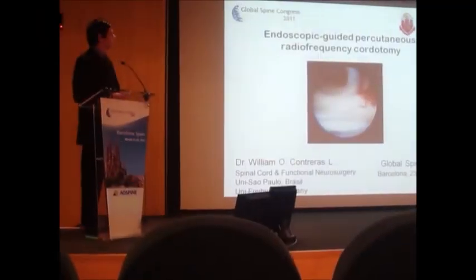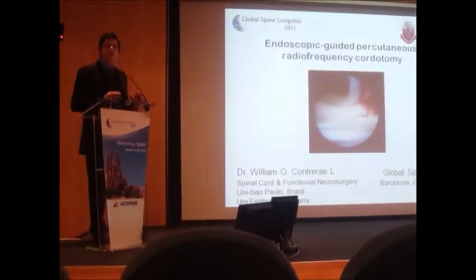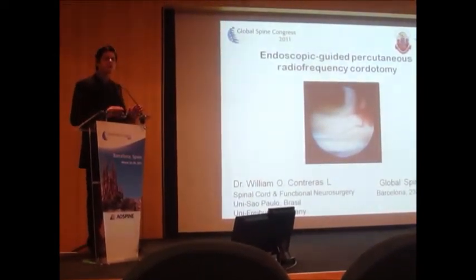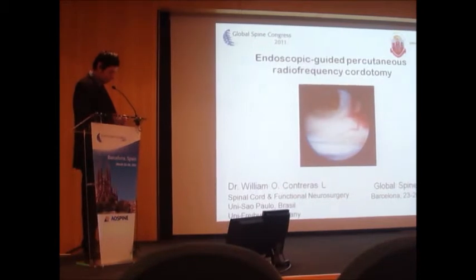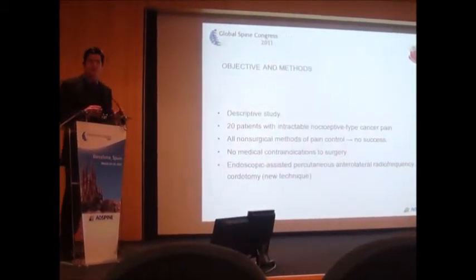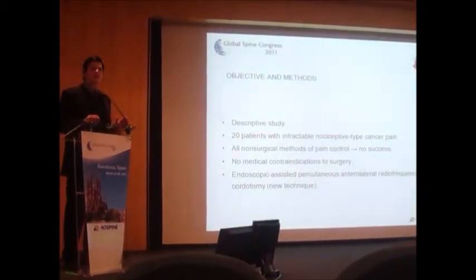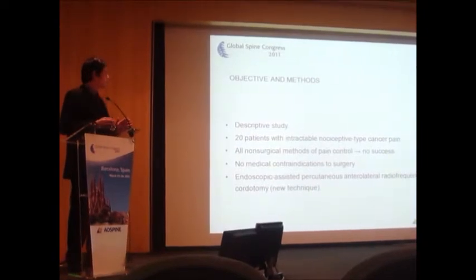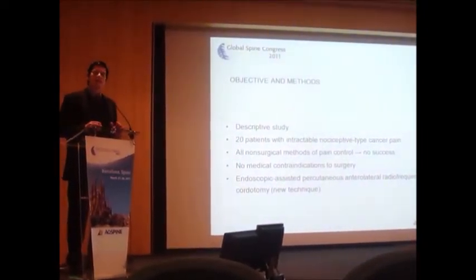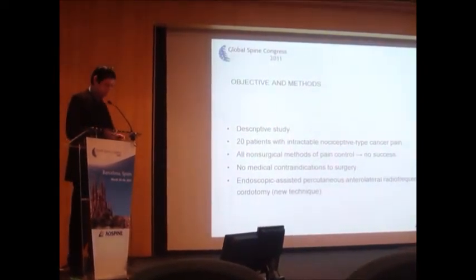Clinical implementation of an endoscopic visualization of the cervical spinal cord in cordotomy for untreatable pain syndromes. So we treated 20 patients with nociceptive pain from malignant cancer who had no success with other treatment options, like even putting in an opioid infusion pump.